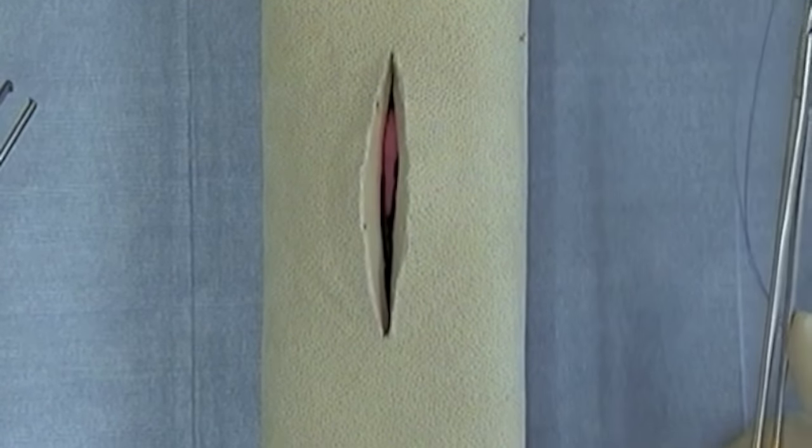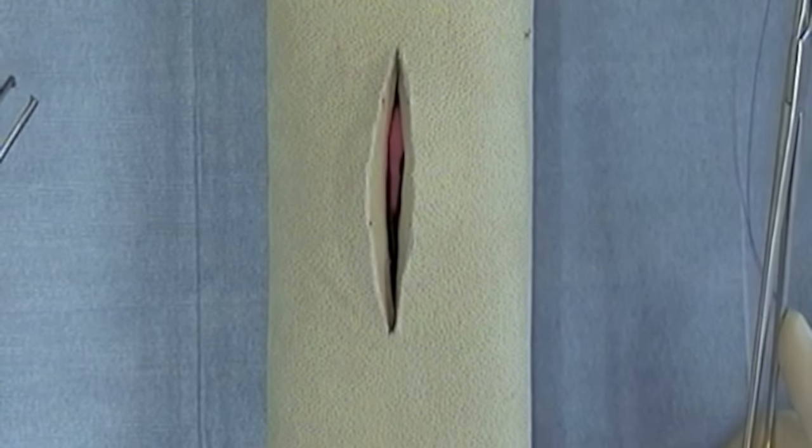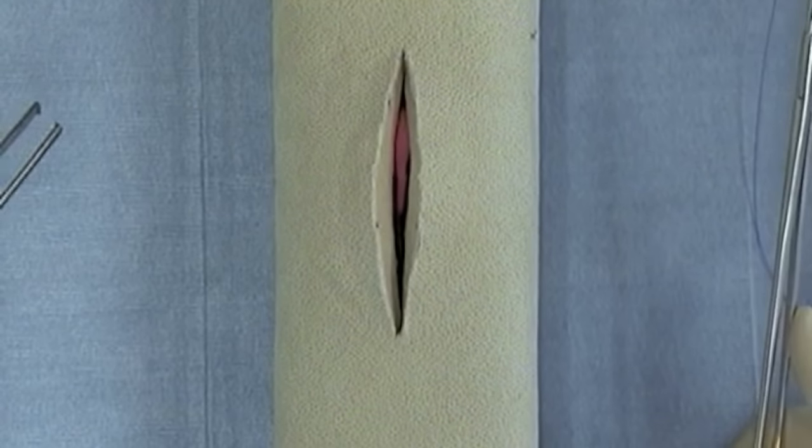The vertical mattress pattern is a far, far, near, near suture pattern to construct.